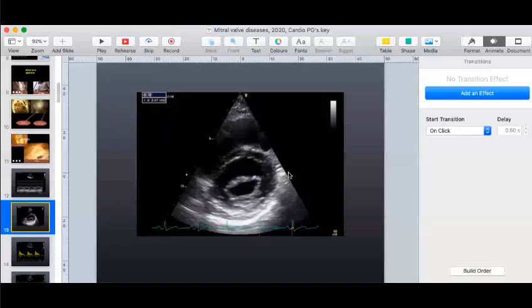So you start from the apex or the papillary level, and then you sweep it up. So as you keep coming towards the mitral valve, the smallest orifice is what you try to get, and that is the one which you end up doing the area. Now, what are the limitations of this particular method? What can cause problems? What can get you into trouble?